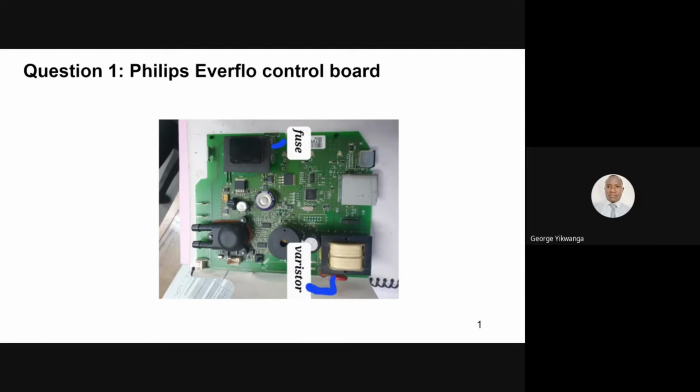Varistors are easily available in the market, almost everywhere. Generally, this part of the PC board is damaged due to power fluctuations, so we strongly suggest that you use a voltage stabilizer to overcome this kind of problem. Thank you so much.